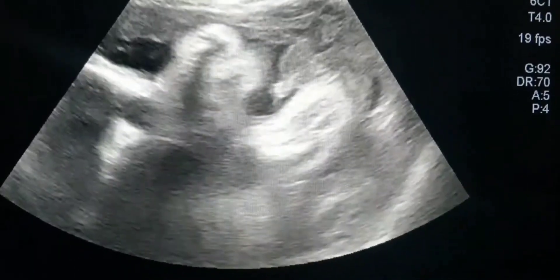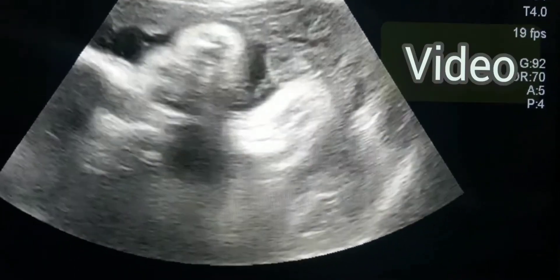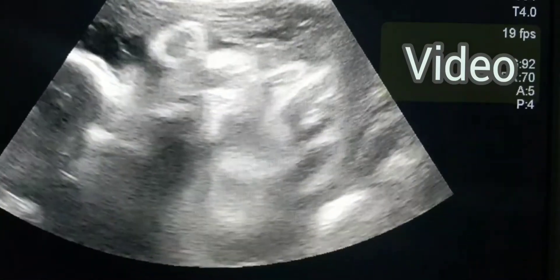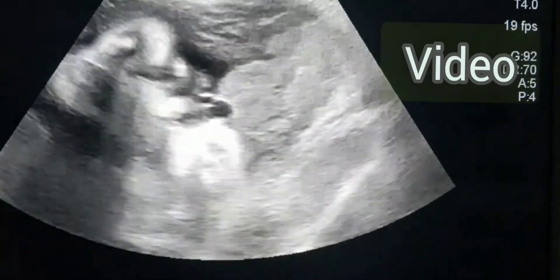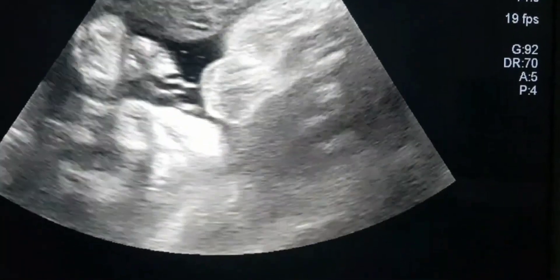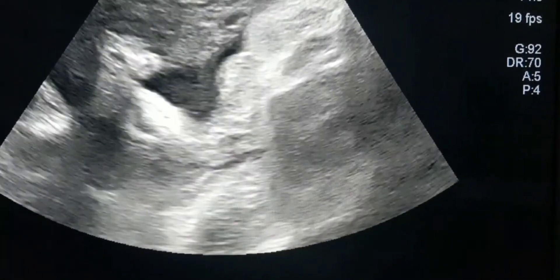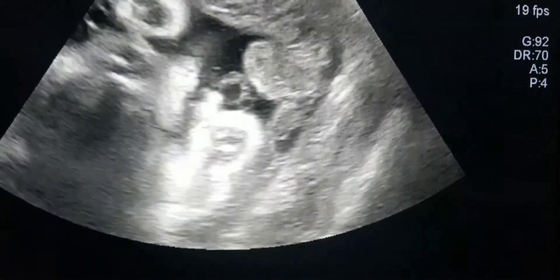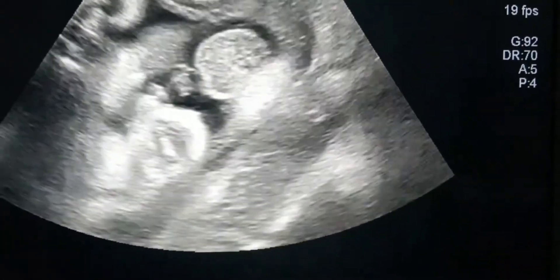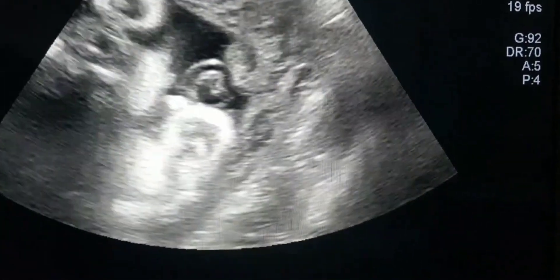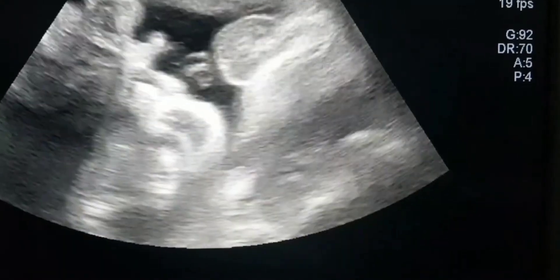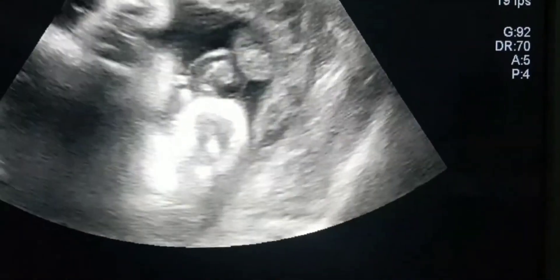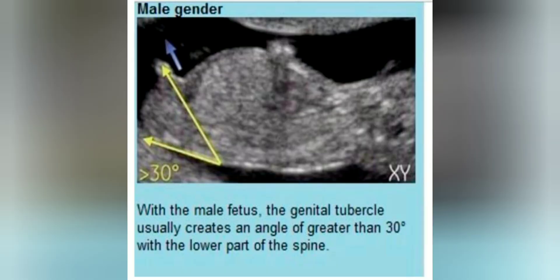You have to find the pelvic region and between both legs you can find the sex of the baby easily. Normally for a male baby you can find the scrotal sac and the penis, but if you are unable to find any scrotal sac then you can tell this is a female gender.